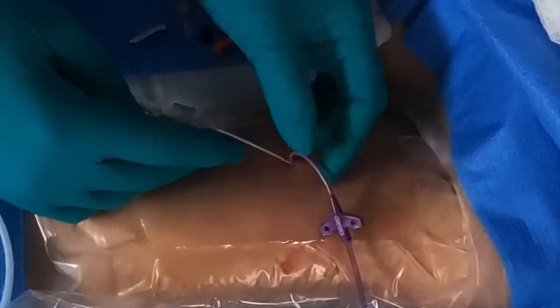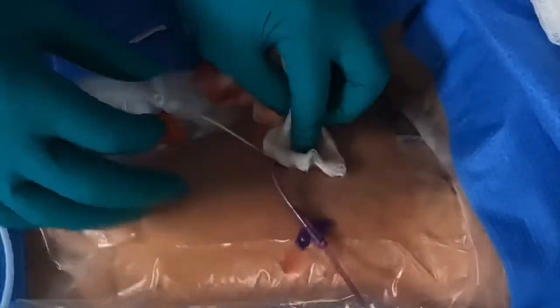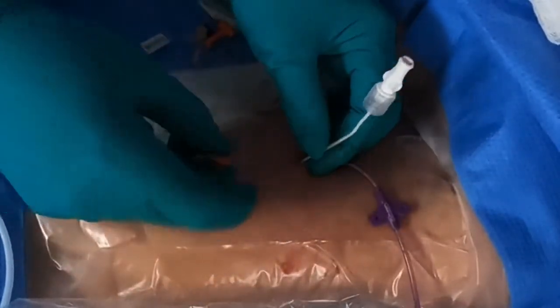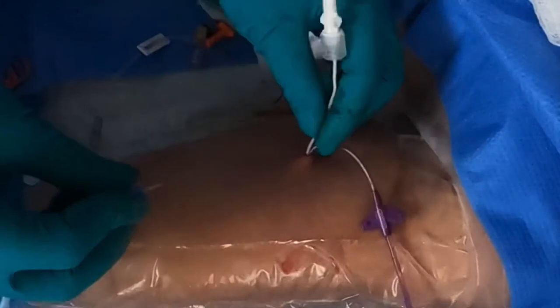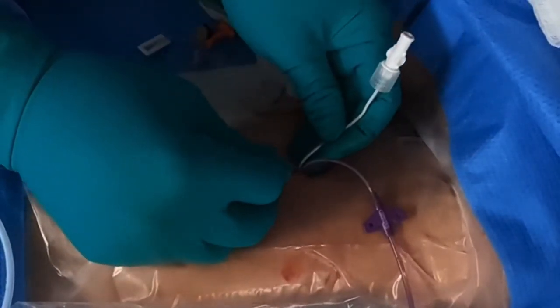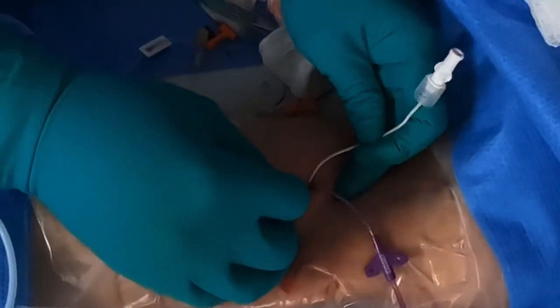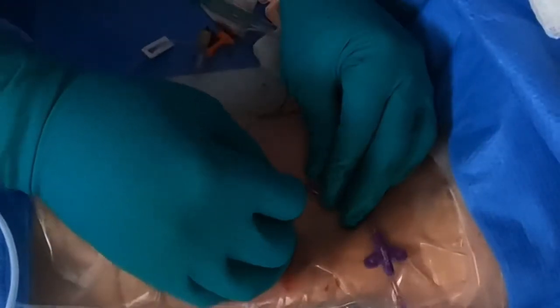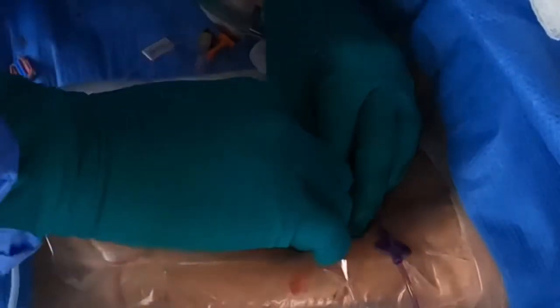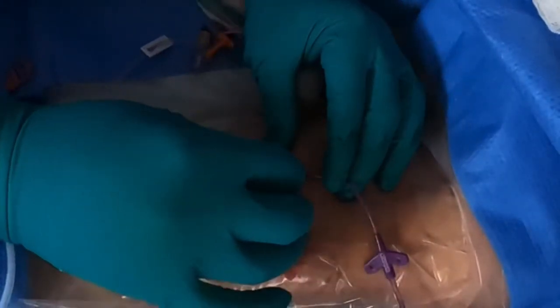I'm going to re-dilate because the skin is elastic and has memory, so it'll go back to its original form. I'm going to let that sit there and dilate. Any pain there? No. Good. Don't expect there to be. So while that skin is dilating — give it a second or two — I'm going to try to replace it almost like an Indiana Jones move here, before it goes back to form. Just pain from the pressure? That's it. Yeah, there's no pain. Good.